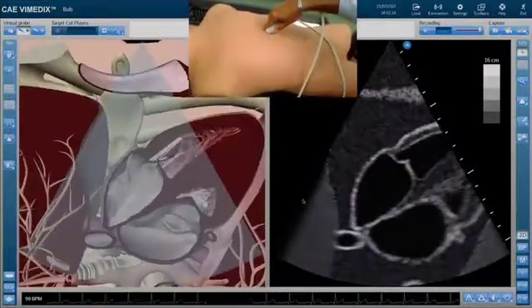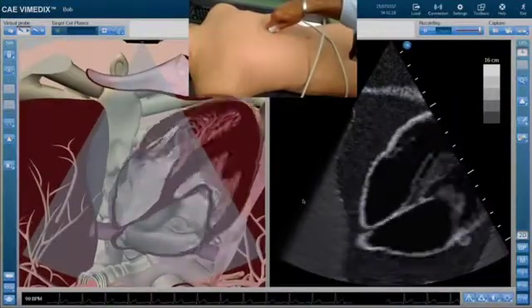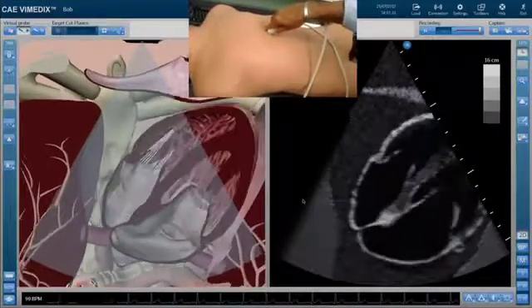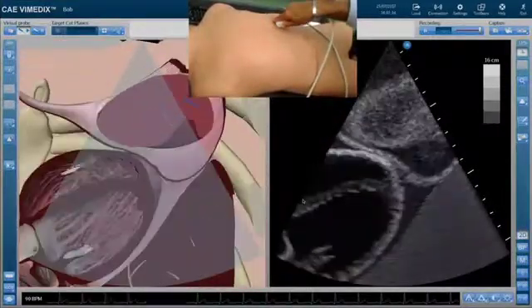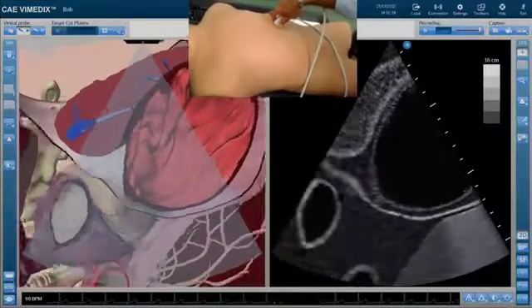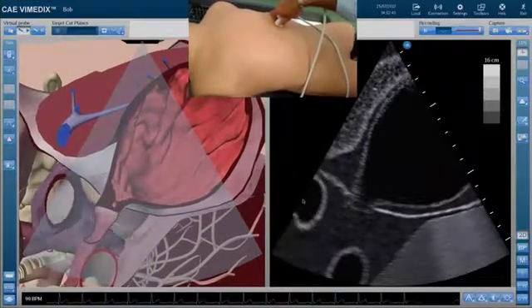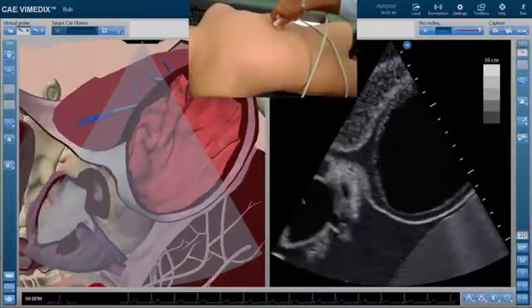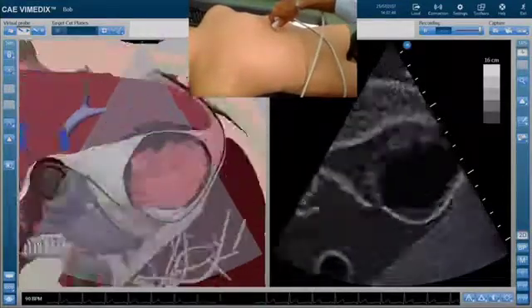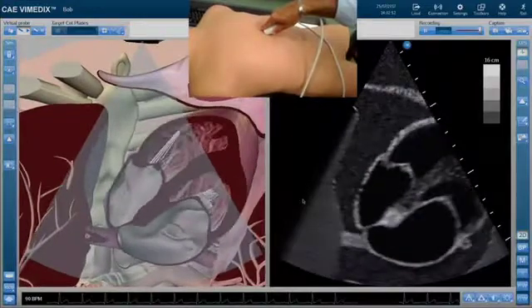The reason why we want to identify the liver is because we need our ultrasound window to insonate through the liver to be able to see the cardiac structures appropriately. Let me show you by sliding over here. If we have bowel, you won't be able to see cardiac structures because the air in the bowel will prevent insonation up into the cardiac silhouette. Therefore, the first step when you're trying to identify cardiac structures from the subxiphoid window is to make sure that you're insonating through the liver. And that's what we see here at the top of our screen.